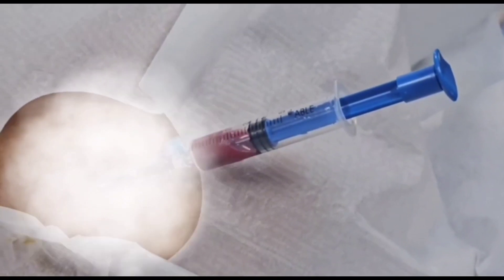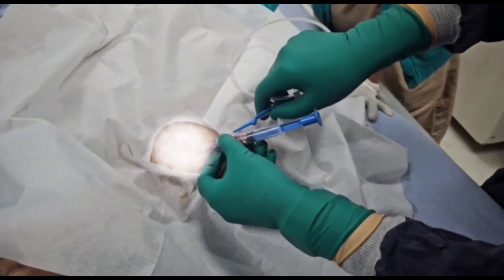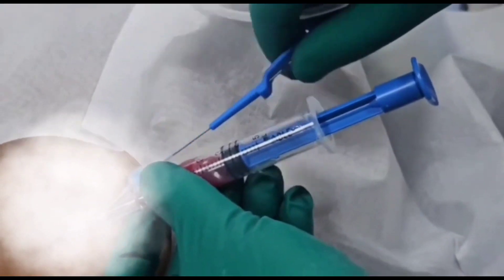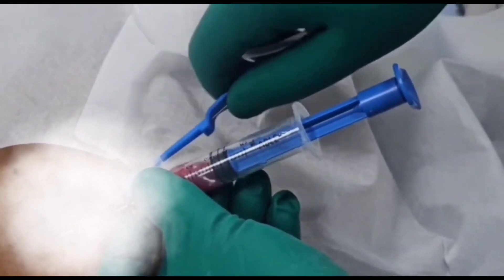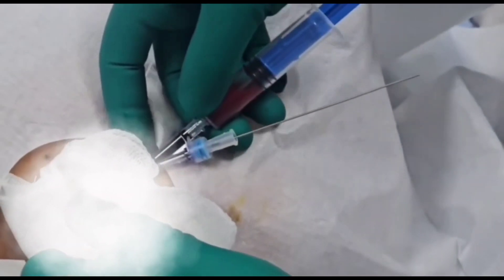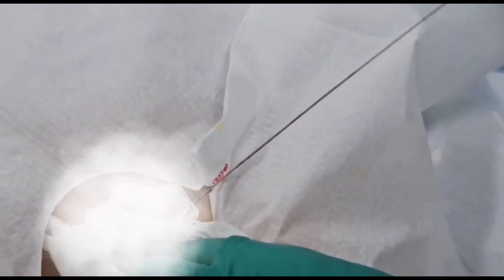We see a flash of blood inside our syringe, and then we pass the guidewire through the side port. The guidewire should be introduced very smoothly. If it does not go in smoothly, the needle may be displaced from the right subclavian vein. We then pull out the needle, leaving the guidewire inside the subclavian vein.